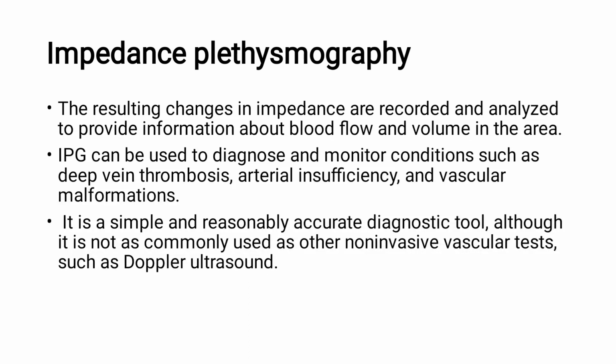This is mainly used to monitor and diagnose conditions such as DVT, that is deep vein thrombosis, then arterial insufficiency and vascular malformation. It is a simple and reasonably accurate diagnostic tool, although it is not as commonly used as other non-invasive vascular tests such as Doppler ultrasound.